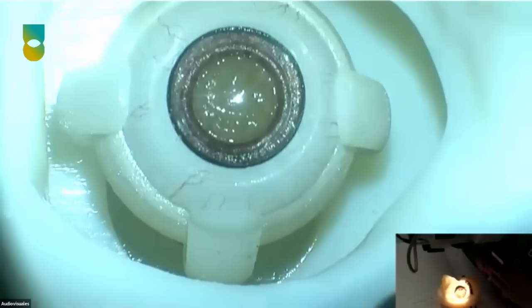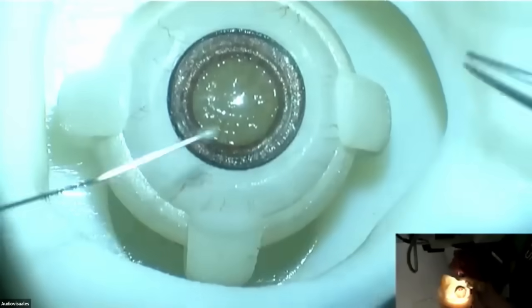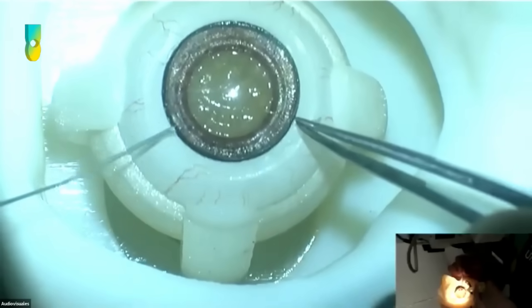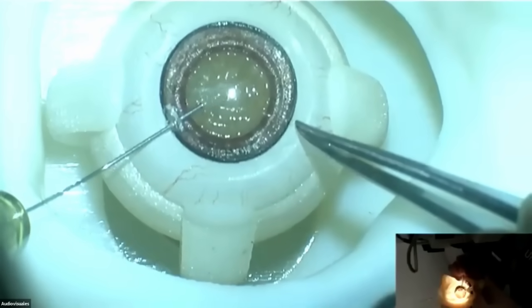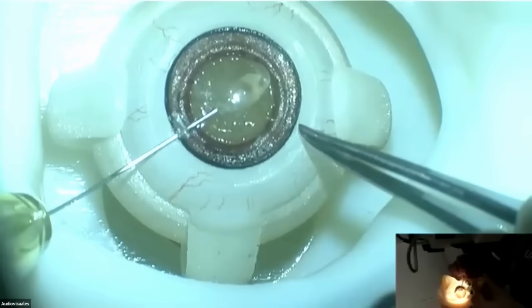You start to talk to the patient, don't move, and that's not the way. That's when things get worse. You have to try not to fight against the eye, fight against the patient, but rather make things smoother. One idea is to use a cotton swab to fixate the eye.